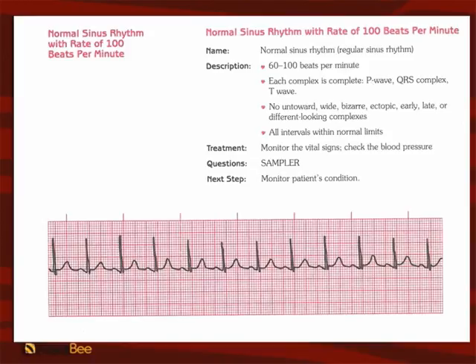So make sure you're only counting the number of complexes within 6 seconds. So if you look at this strip, you will be able to count the number of complexes. So you go ahead and do that for yourself.